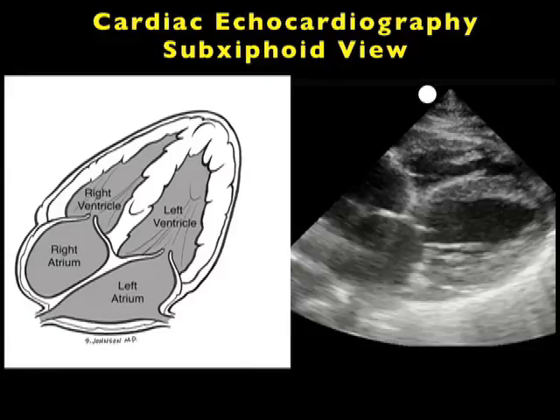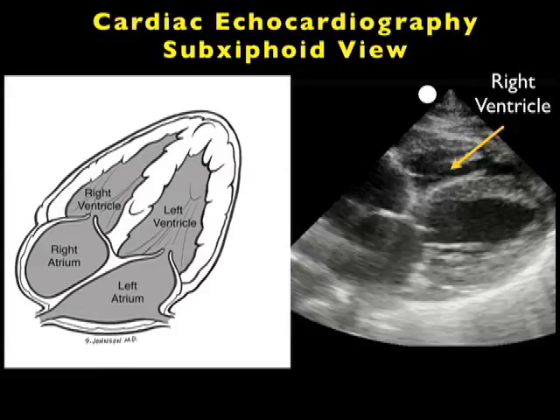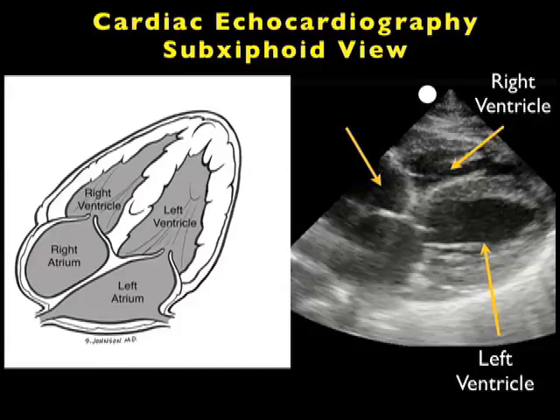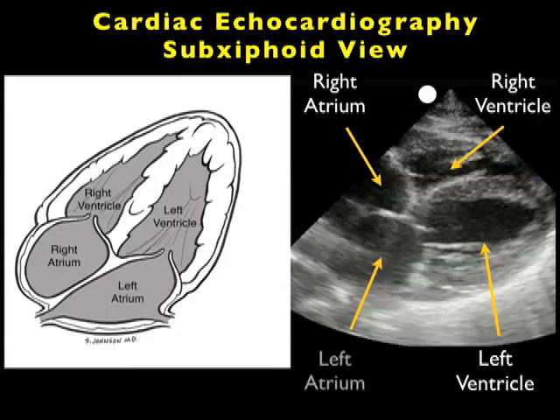Let's take a look at the image obtained from the subxiphoid view. Here's a pictorial to the left and an ultrasound image to the right. The first chamber encountered directly below the liver — our acoustic window onto the heart — will be the right ventricle. Immediately posterior to the right ventricle we see the left ventricle, which has more muscular and hypertrophic walls. From this plane we can also image the right atrium to the left of the right ventricle and the left atrium just to the left of the left ventricle. We can also appreciate the white line of the pericardium circumferentially surrounding the heart.